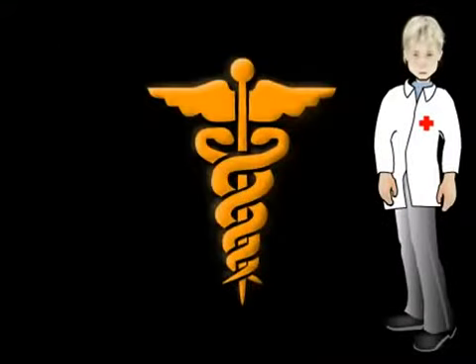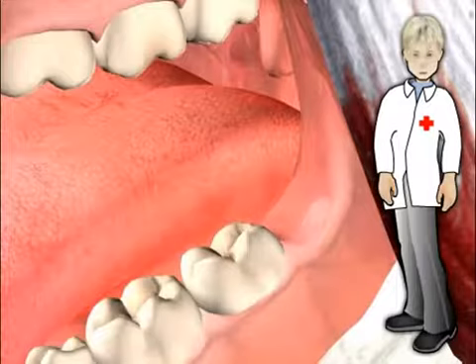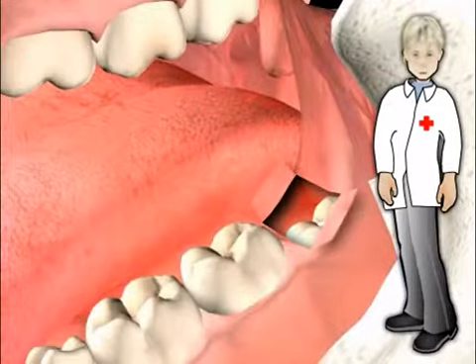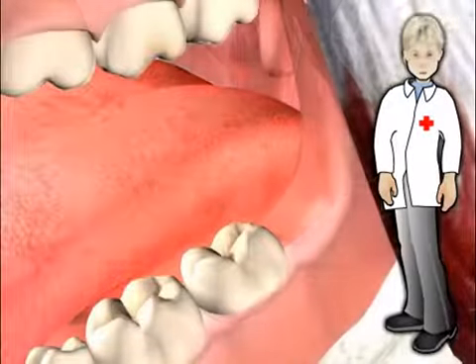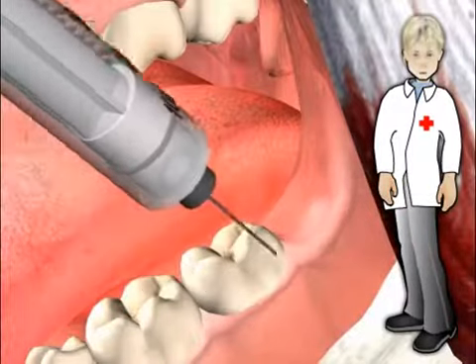We will spare you explanations of individual medical terms, such as retained, partially retained, or impacted, because the treatment consequence is always the same. Depending on the position of the particular wisdom tooth, the mucous membrane must sometimes be opened more, in effect moved to the side, and more or less bone must be removed. As a rule, surgery is performed under local anesthesia and is a routine operation.